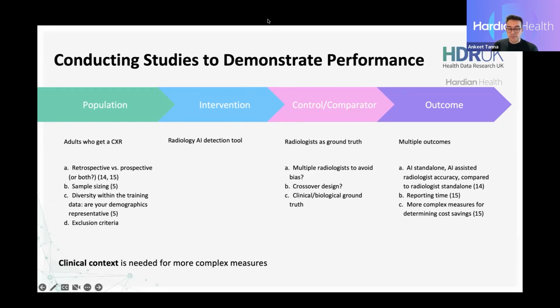Another thing to touch on, separate to radiology AI, is, for example, for more advanced diagnostic tests, oftentimes in an AI or deep learning context in an academic setting, there are outcome measures which are preferred. So for example, F1 scores and other kinds of harmonic means, which are incredibly helpful in terms of understanding the balance of sensitivity and specificity.